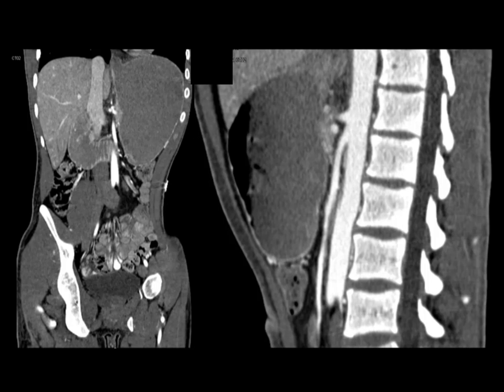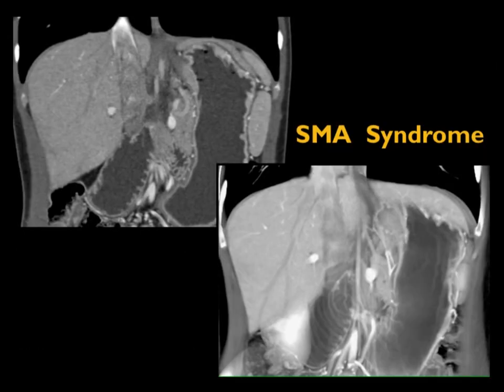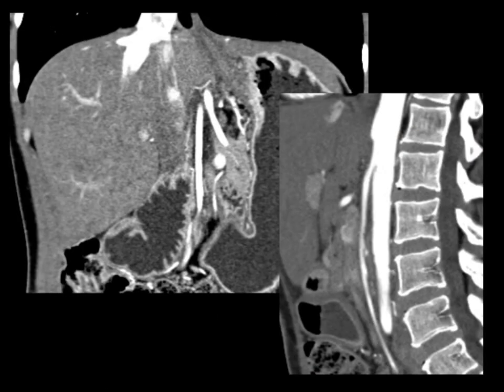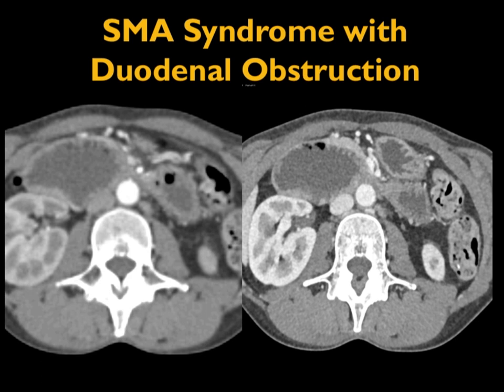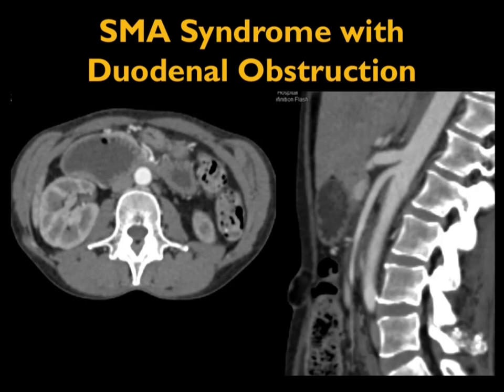In this case, there's the cutoff at the SMA and marked narrowing of the SMA angle, very well seen in this study. Another example: dilated duodenum, the SMA transition, and the dilated loop of bowel — very nicely shown, classic SMA obstruction. Here it shows the dilated loop, the markedly decreased angle, and the markedly decreased distance. When you have these findings together, it's very easy to make a specific diagnosis.